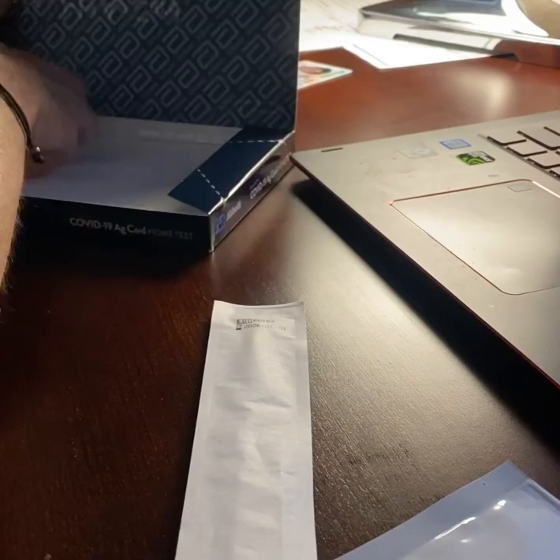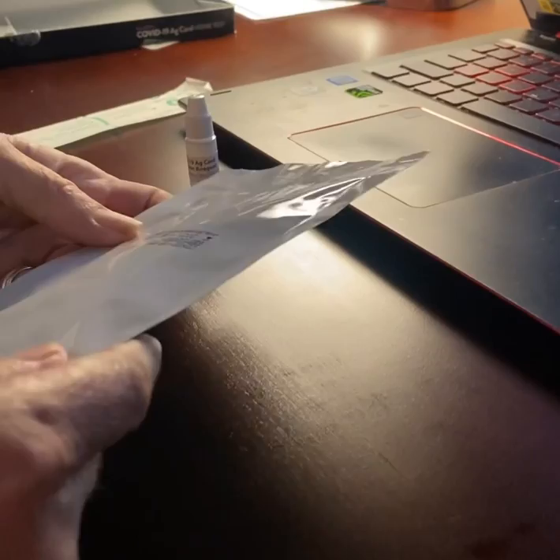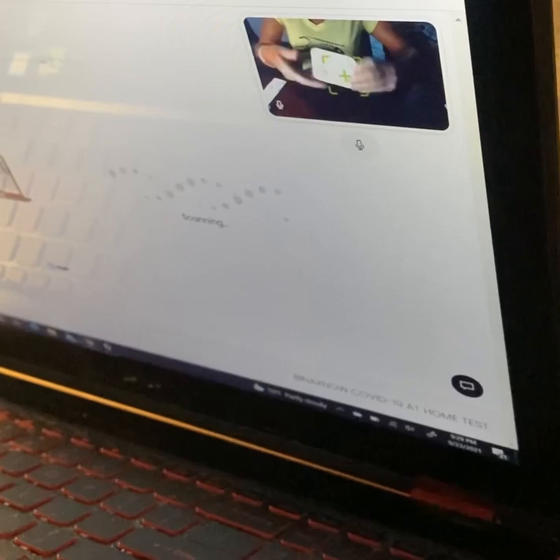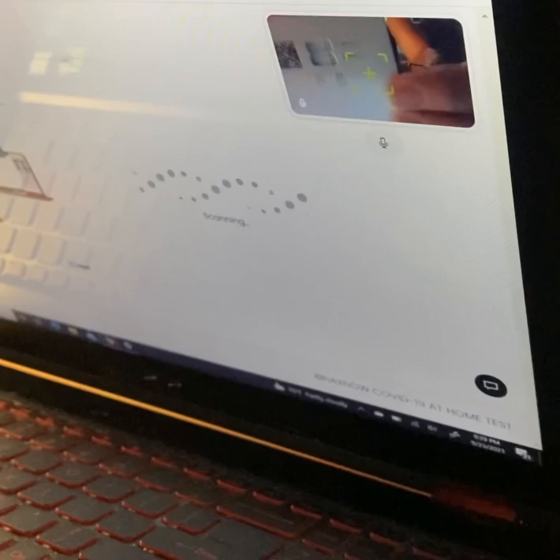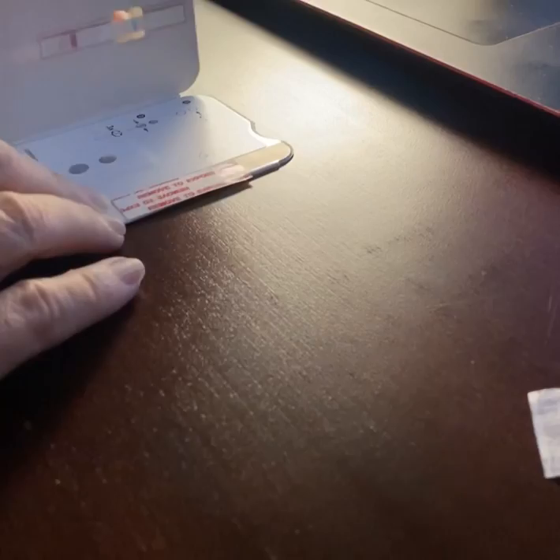Okay, seems like the three items were there. Now, ma'am, you can take the test card out of its package, the white plastic pouch. And then hold your test card in front of your device camera to scan the QR code. Hold it steady. Alright, I got it, thank you. Now open the test card and leave it completely flat like an open book, ensuring the two holes are on the right side of the card. Make sure we do not touch the inside of the test card.